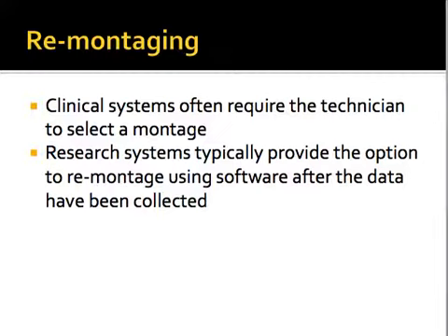I realize that we have not talked about coherence and connectivity and a lot of these things at this point. We will discuss those in one of the lectures associated with this class. Just giving you a heads up that there have been some publications and studies done on whether the montage makes a difference when you're analyzing EEG, and the answer is yes, it does. So if you're doing a particular study and you know what kind of model you want to use after the fact, it may be worth thinking about how the electrode arrangement is set up before you begin to acquire that data.